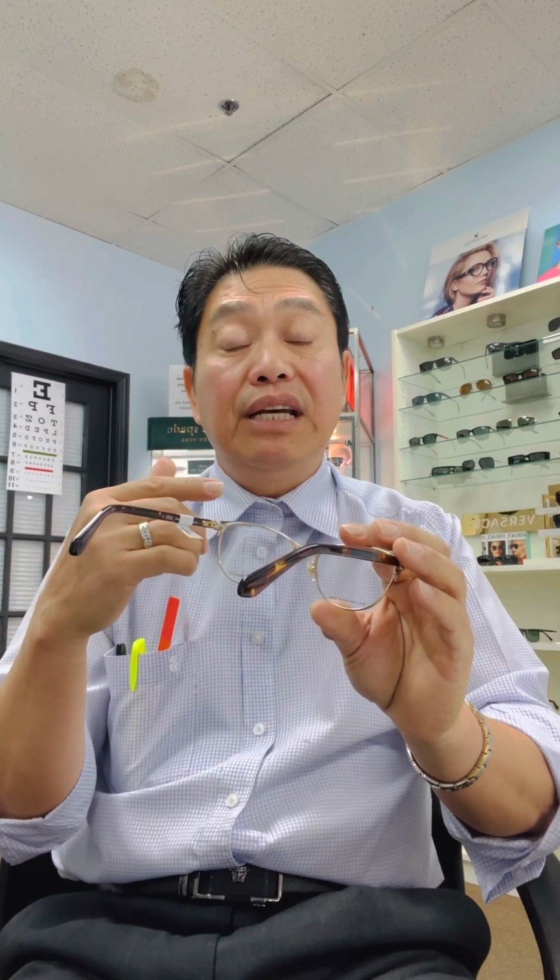If you have an allergic reaction to metal, I would recommend you choose the titanium, because titanium is a hypoallergenic material. It does not trigger your allergic reaction to metal. Okay, and they're very lightweight. Stainless steel is also a lightweight material. I really like metal frames because, as I said, adjusting these frames is very easy.